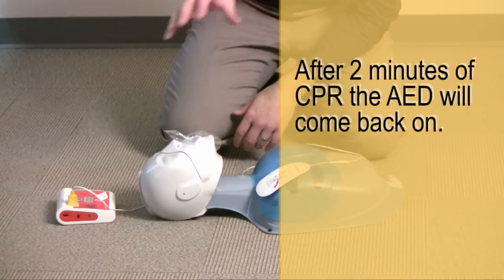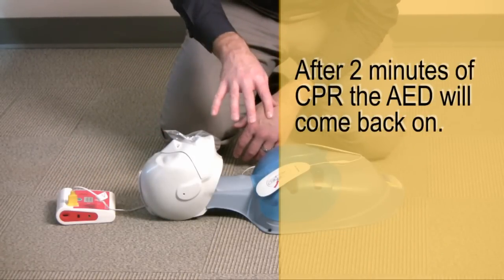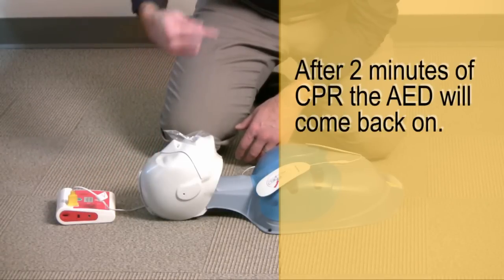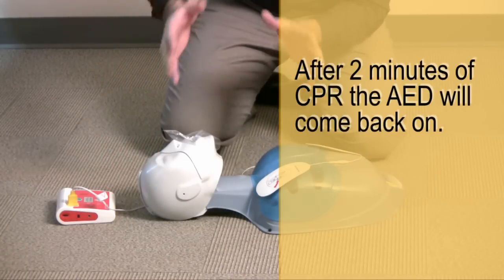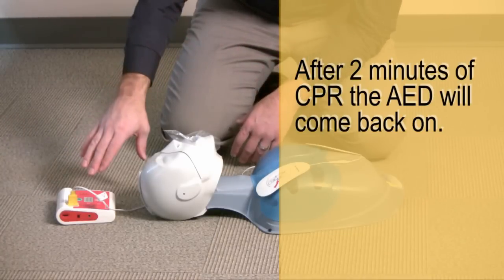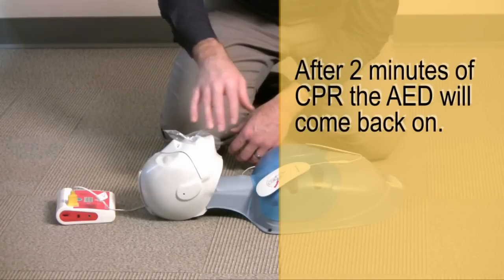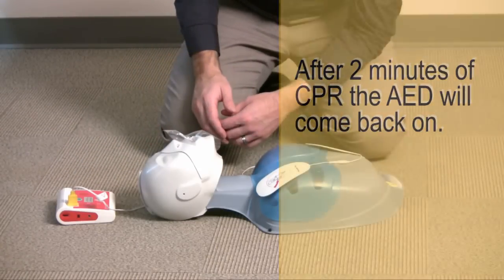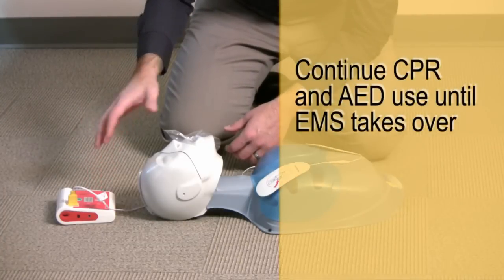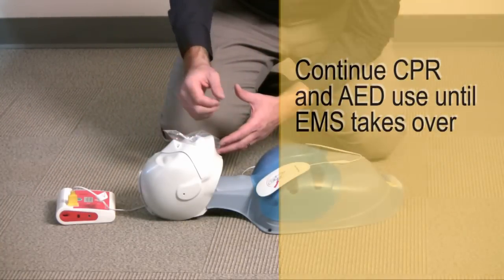Now I'm going to keep doing this cycle, compressions and ventilations, for about 2 minutes or about 5 rounds. Once the machine has delivered a shock, it actually internally counts down that 2 minutes to allow CPR to make sure the blood is moving through the casualty. So after 2 minutes, the machine's going to give an audible signal to tell you to stop CPR so that it can reanalyze the casualty. Now you're just going to continue this process, allowing the machine to analyze and CPR until emergency medical help comes along and takes over from you.